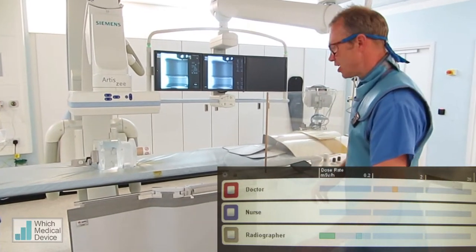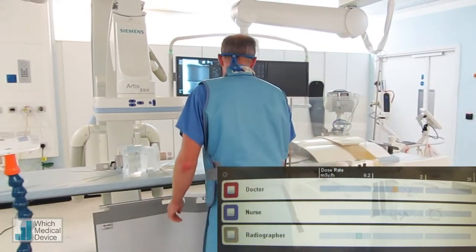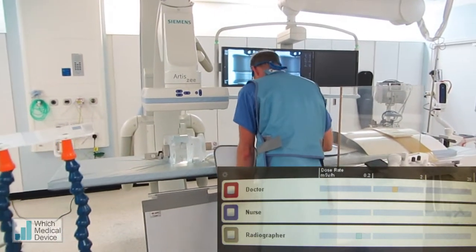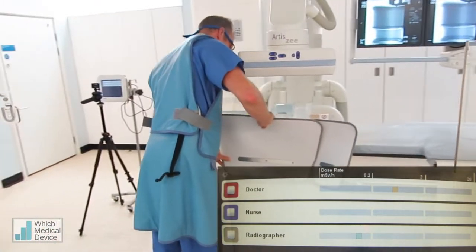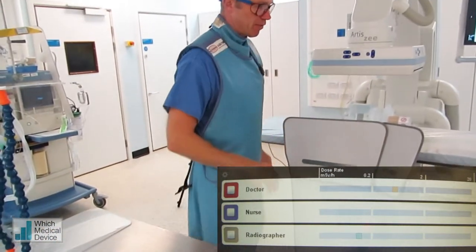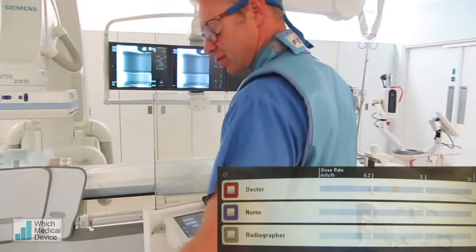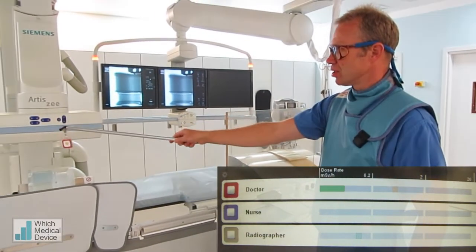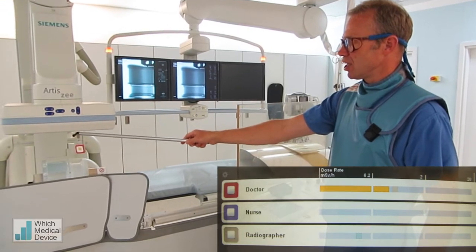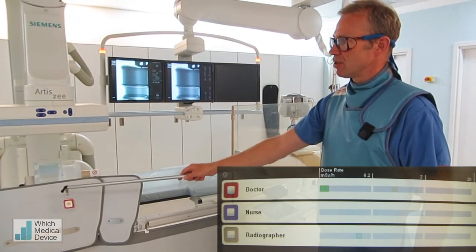That lead screen can be improved even further by adding some additional lead protection a little bit higher up, which will protect you even more from the scatter coming back from the patient. And again, that's going to give you a significant dose here, but when we're coming down, it's going to be virtually zero.